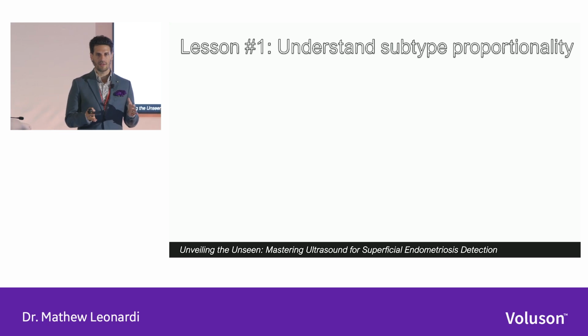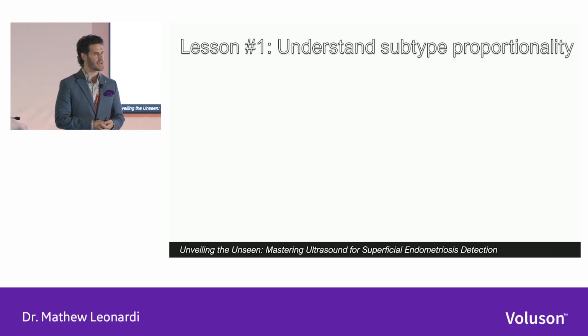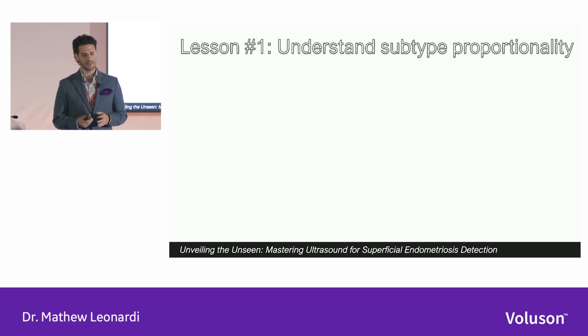The format of the talk today is going to be very lesson-based. So if people like to make notes, there's going to be lessons, and these are the main concepts to take away back home and start to implement them. The first lesson is really in understanding endometriosis subtypes.